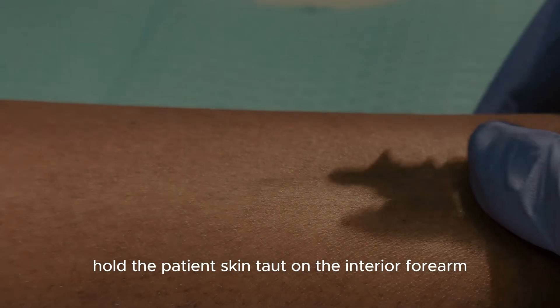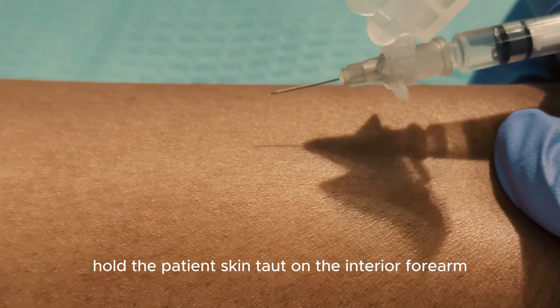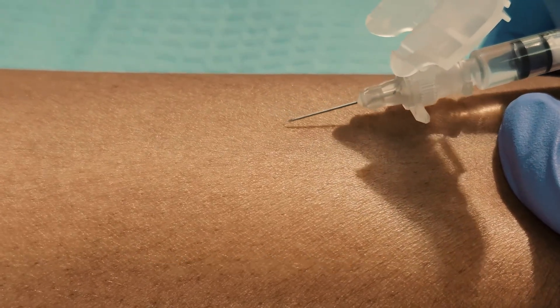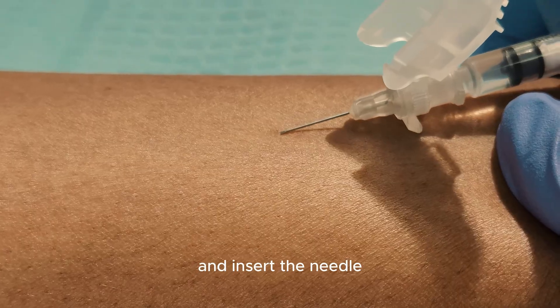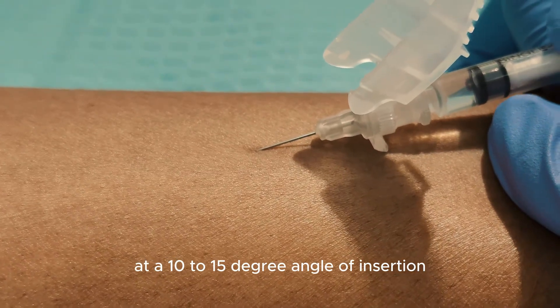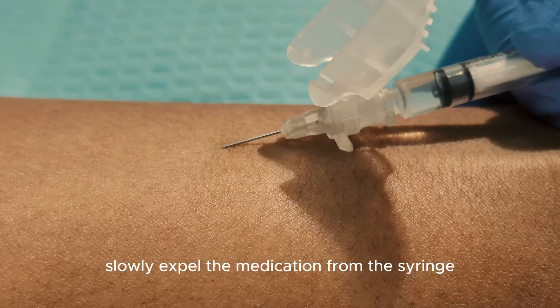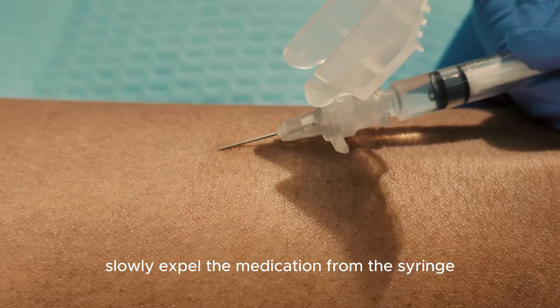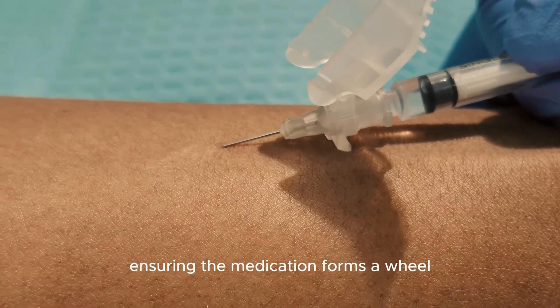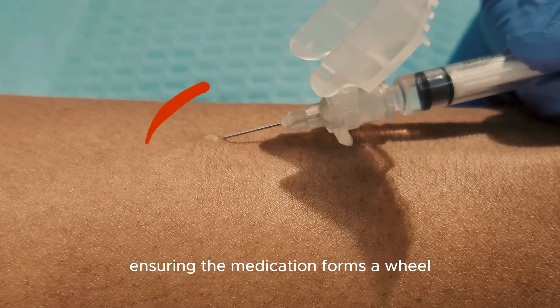Hold the patient's skin taut on the anterior forearm between your thumb and fingers, and insert the needle at a 10 to 15 degree angle of insertion. Slowly expel the medication from the syringe by depressing the plunger, ensuring the medication forms a wheal.